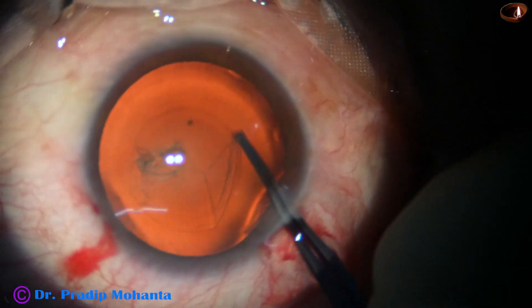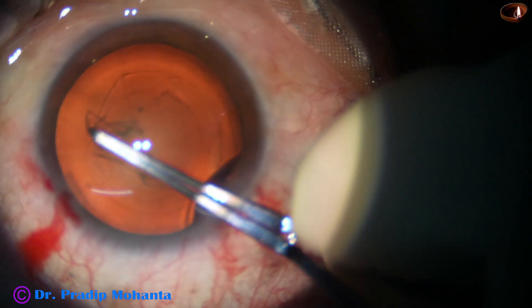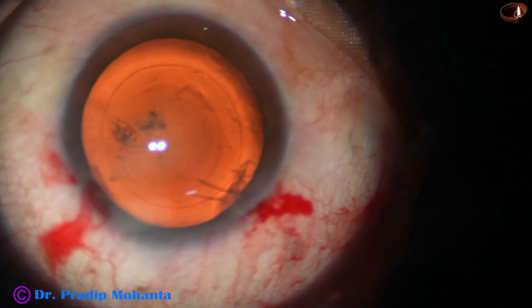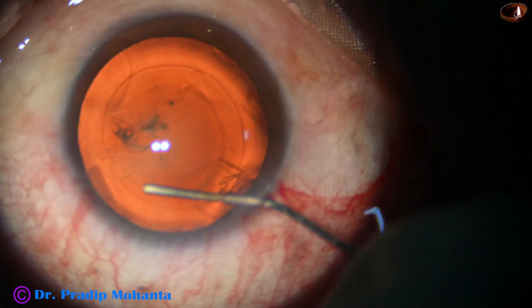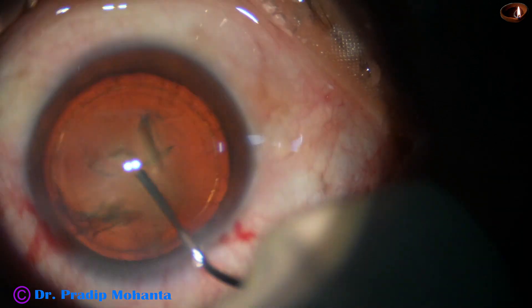And now with stereo coaxial illumination, capsulorhexis is being done. This is the Lumera T microscope from Zeiss. A round rhexis has been achieved. Now hydrodissection is done, and hydrodelineation has also been done in this case.